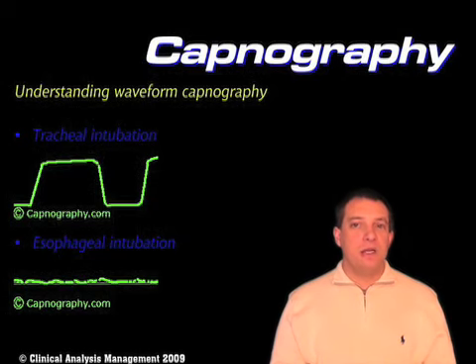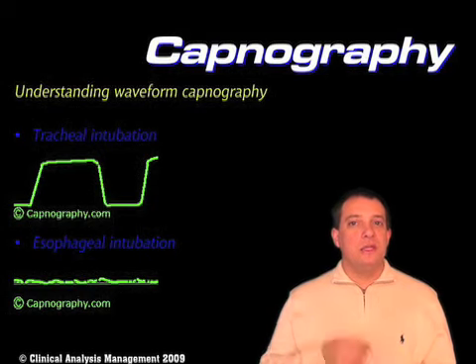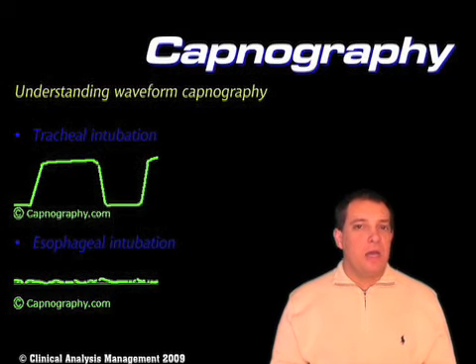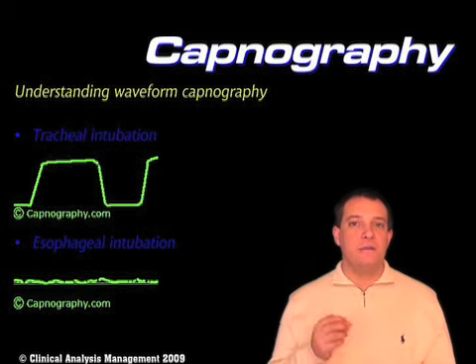Now, one of the things that I do want to point out is that when we esophageally intubate somebody, in some patients there may be some level of CO2 in their belly. So while you would think that if you stick it in their belly you would just have a plain flat waveform, that may or may not be the case. You may actually have some amount of CO2 when you bag somebody in their belly, especially if they've just recently had any kind of carbonated beverage like a Coke or something like that.